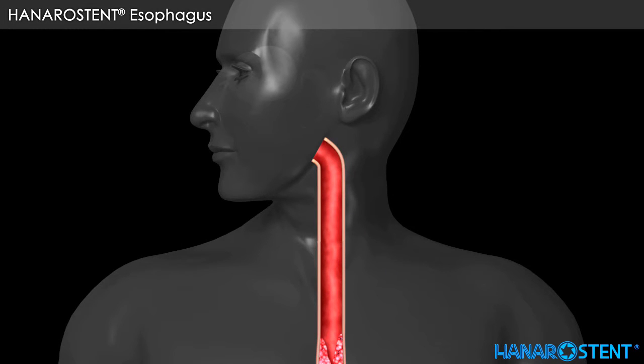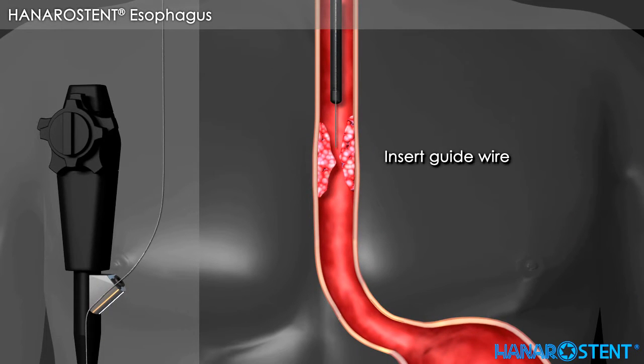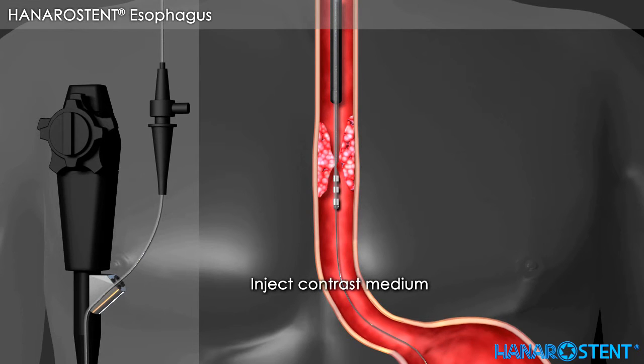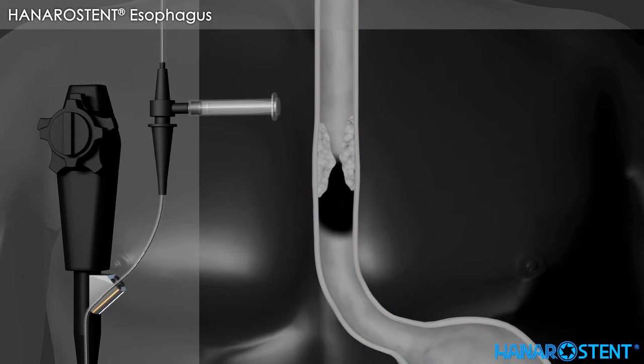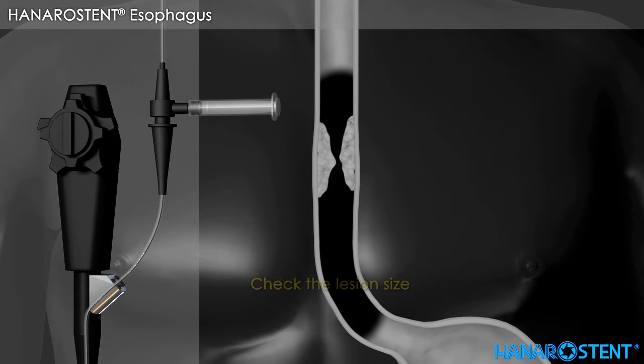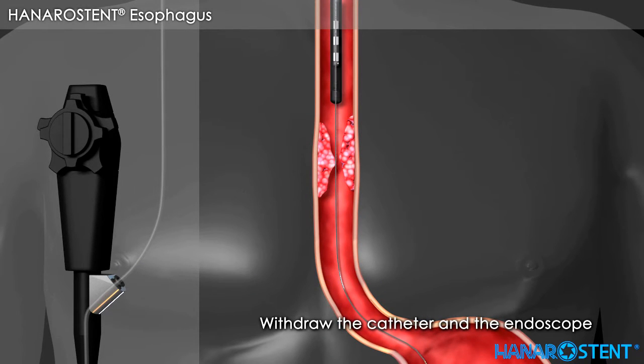Here is a short overview of esophageal stenting. Advance endoscope. Insert guide wire. Insert the catheter through endoscope. Slowly advance the guide wire and catheter. Inject contrast medium. And check the lesion size through fluoroscope. Withdraw the catheter and the endoscope.